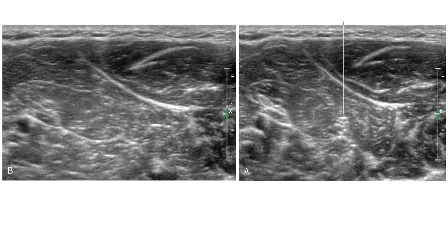This quality leads to the ultrasound image varying depending on the angle between the structure of interest and the ultrasound beam — also called the angle of insonation. When the angle of insonation is perpendicular to the nerve, the nerve appears bright and normal. However, as the angle of insonation increases or decreases away from 90 degrees, the nerve can take a hypoechoic appearance.